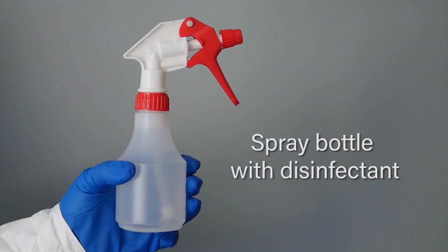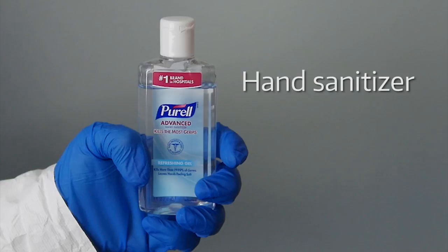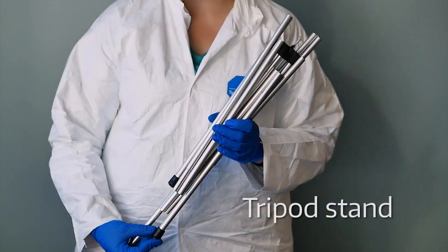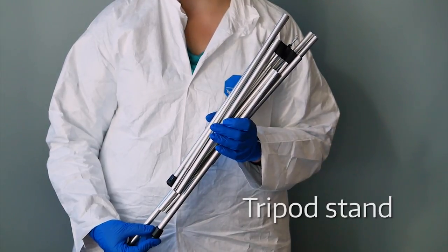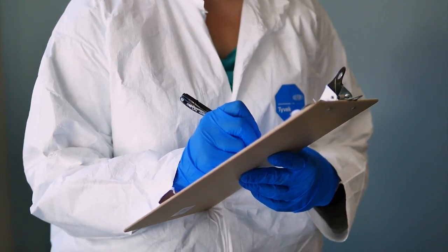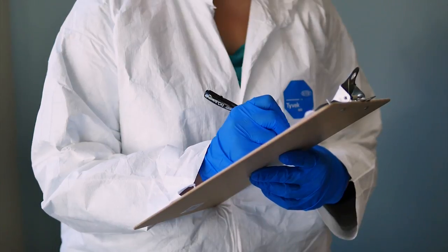Add a spray bottle filled with disinfectant to one side pocket of the backpack, and a bottle of ethanol-based hand sanitizer to the other side pocket. Finally, add the tripod stand to the outer bungee cords of the backpack or the long compartment of the toolbox. Use the checklist to ensure all sampling materials are in the backpack. Now you're prepared to travel to your first sampling site.